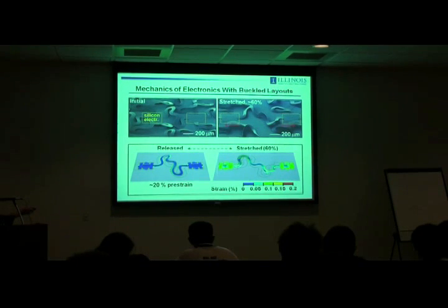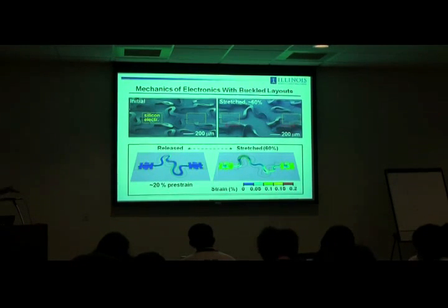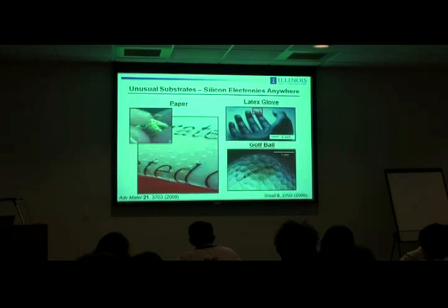Now, the concepts of neutral mechanical plane are implemented in this kind of ribbon. So it's actually a polymer metal polymer stack where the metal's at the midpoint to improve the flexibility of that line. So you can do full finite element modeling. This is what these interconnects look like immediately after fabrication. It's about 20% pre-strain, and this is after stretching to 60% or so. So the strain at the locations of the silicon device is very, very small with these kinds of designs. Now, in a real system, you encapsulate the top of this thing with another low modulus elastomer so that these fragile interconnects don't come into mechanical contact with the environment, which would obviously be a problem.